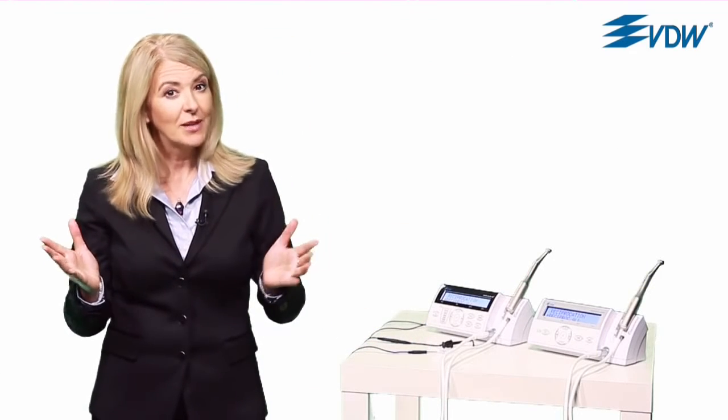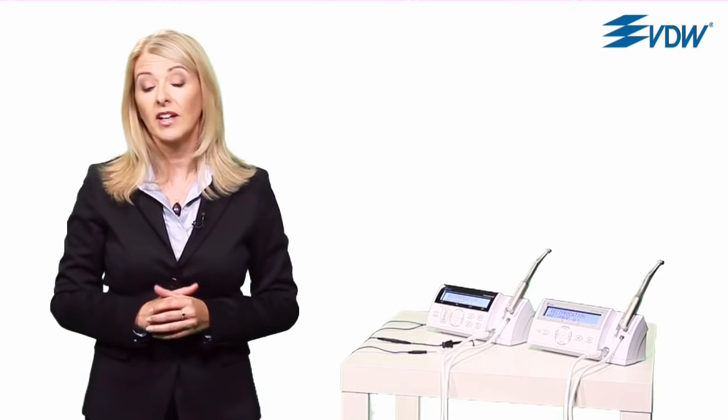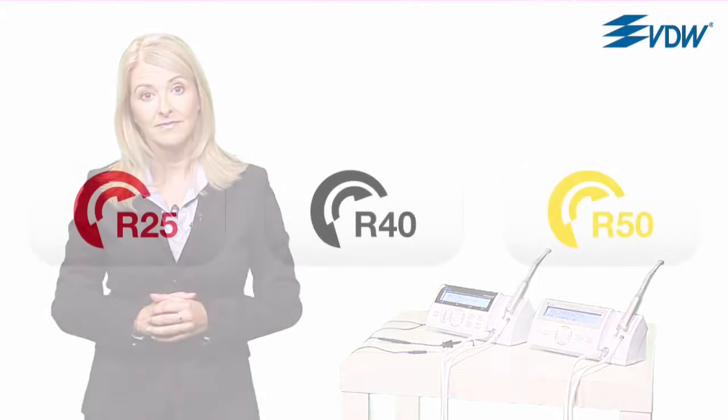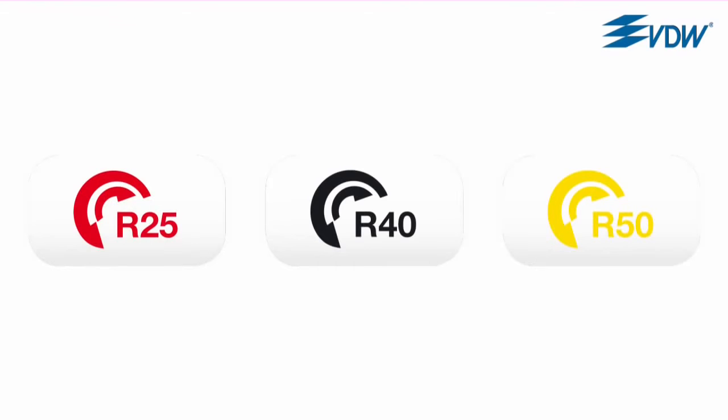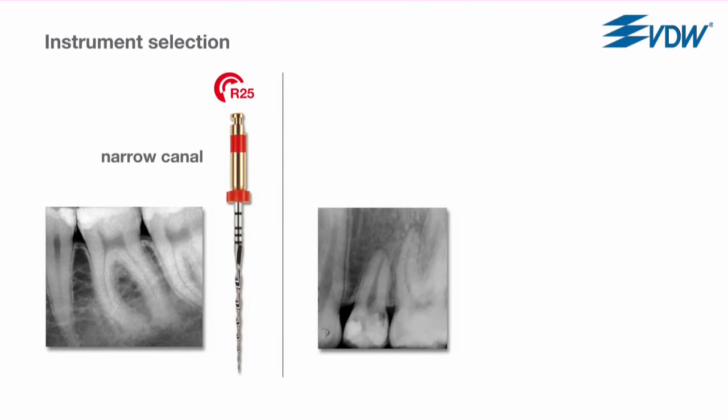So much for theory. Now to practice. Here's an example of preparation with Reciproc in a 3D animation. 3 different instrument sizes are available for narrow, medium and wide canals. With the help of the pre-operative radiograph, you first of all decide which instrument to use. If the canal is partially or completely invisible on the radiograph, use the R25. If the canal is completely visible, it could be either a wide or a medium canal.